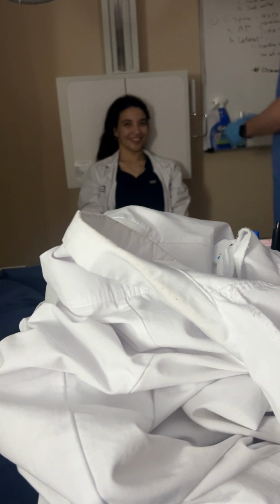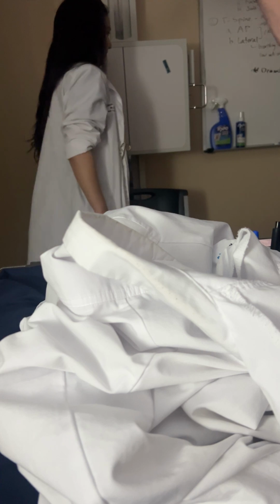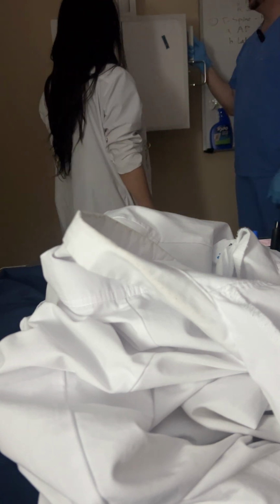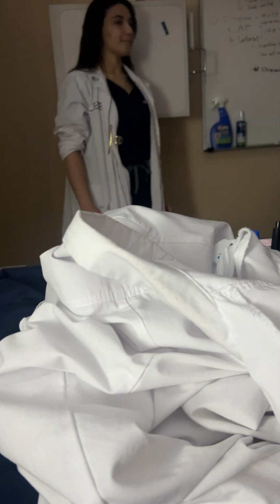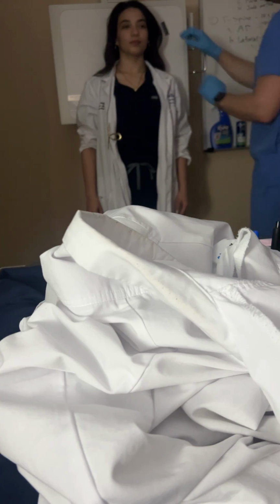Okay. Let me have you stand up. And don't hit your head. PA axial Caldwell skull. How much angulation? 15 degrees caudad angulation. Turn around for me.